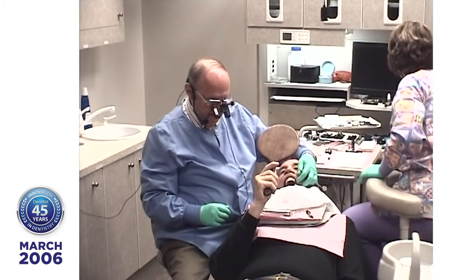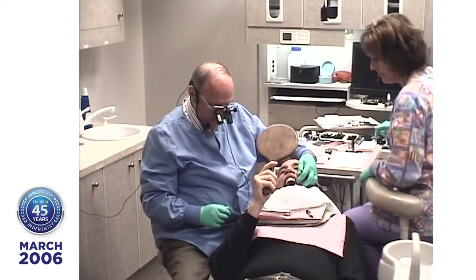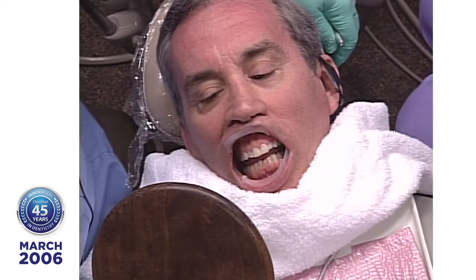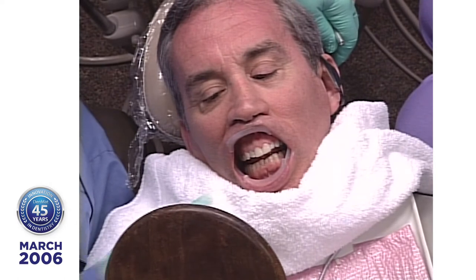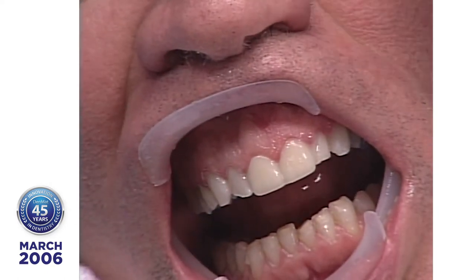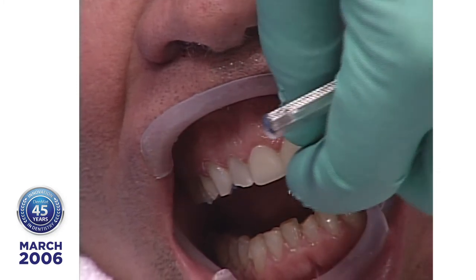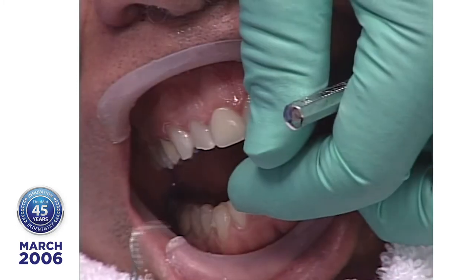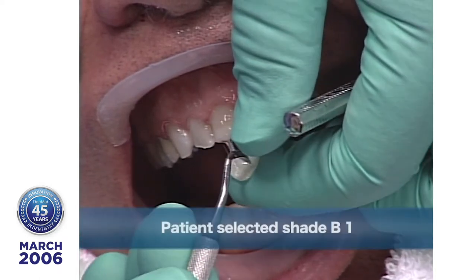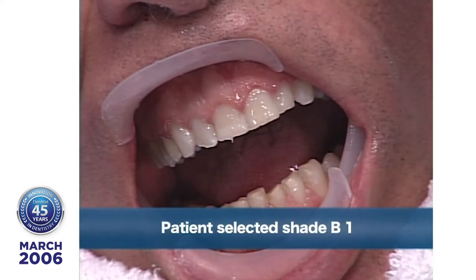You like the left or the right? They're pretty close. The right one? Left one? This one or this one? This one? That one. Okay, that's the one I like too. So I think you made a wise choice there. You always want to congratulate your patients on making a wise choice. We decide on shade B1.